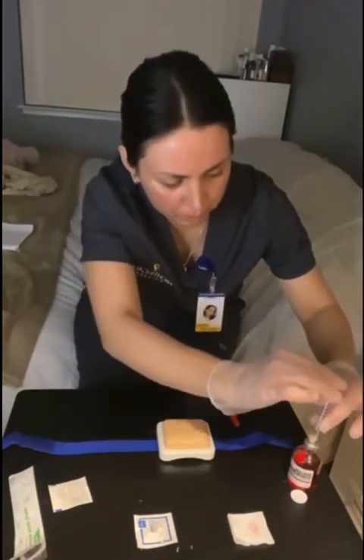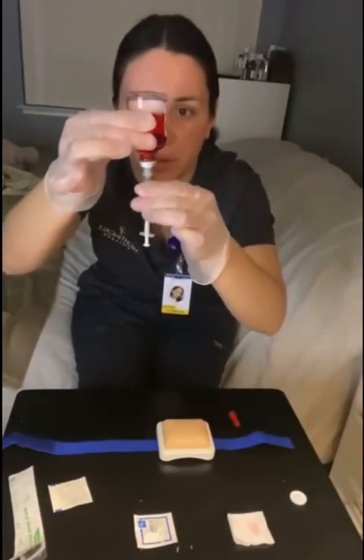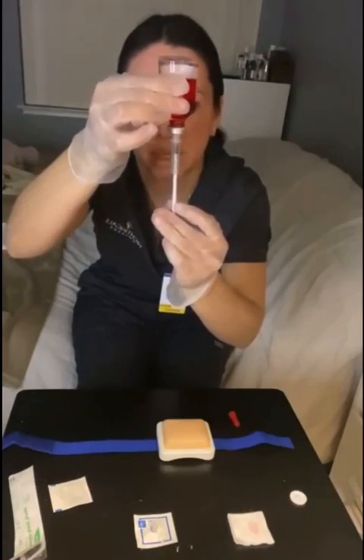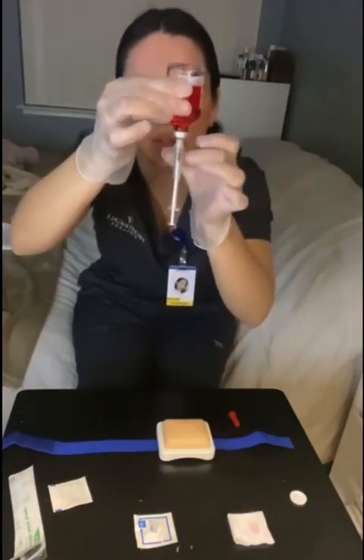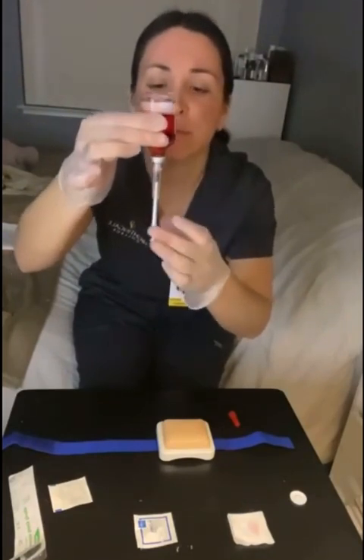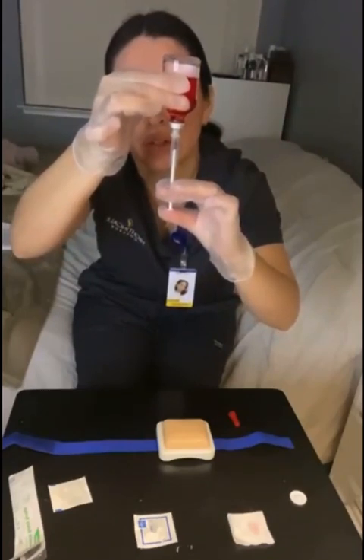And I want to put the air back in. I'm going to turn it upside down and let it go to the 0.1. I can speed up the process a little bit. Let it go to 0.1. And I would tap on the needle to get any air bubbles out. I would insert all the medication back in if needed, if there were still air bubbles. I'm going to push gently back the air into the medication.